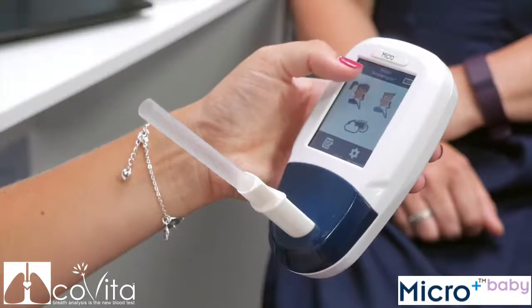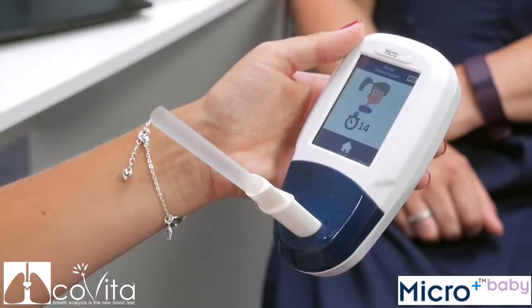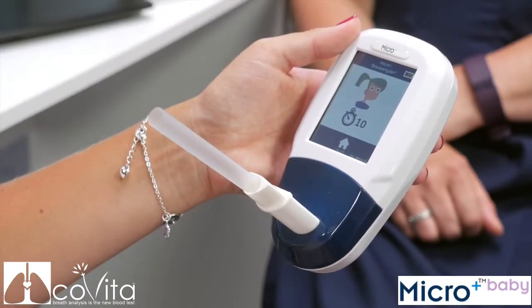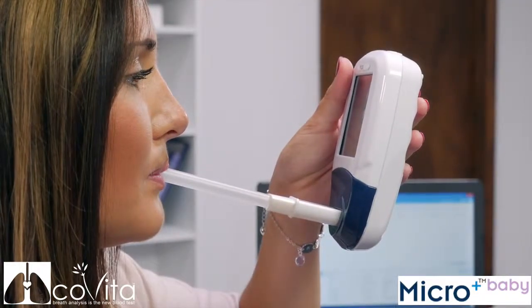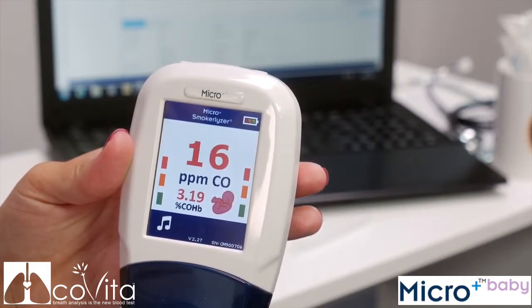Click on the maternity breath test icon to begin. You will be asked to inhale and hold your breath for the preset 15-second countdown before slowly blowing into the Micro. The reading will rise and stabilize on screen, and you can choose to mute the monitor if necessary.